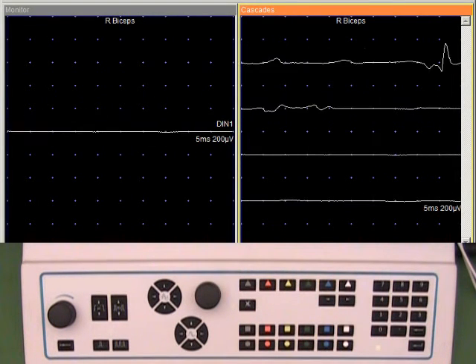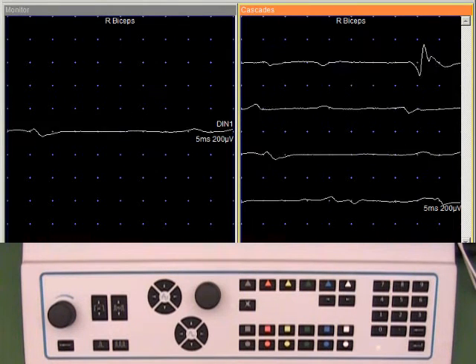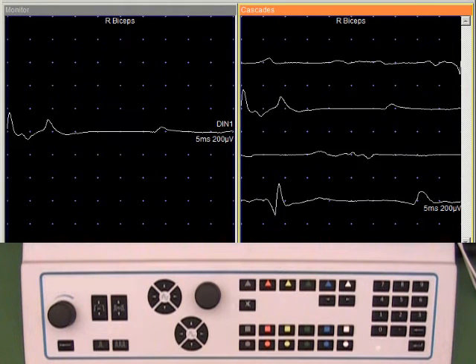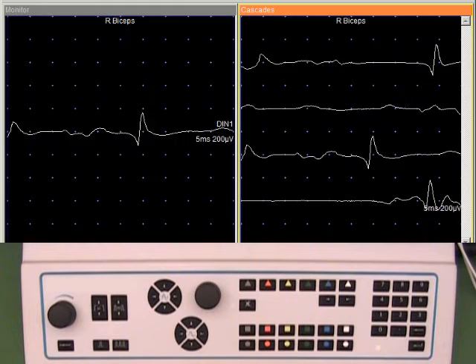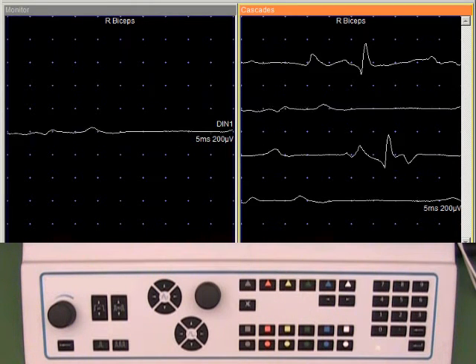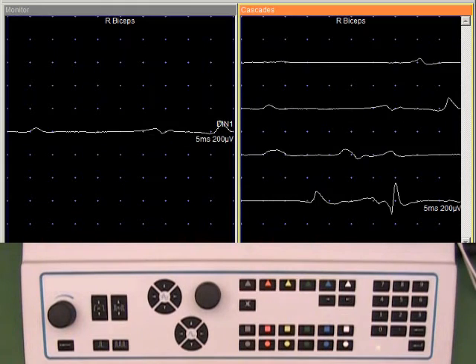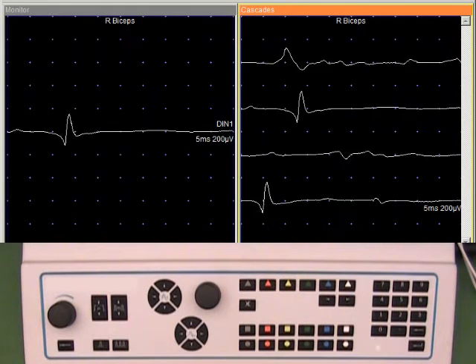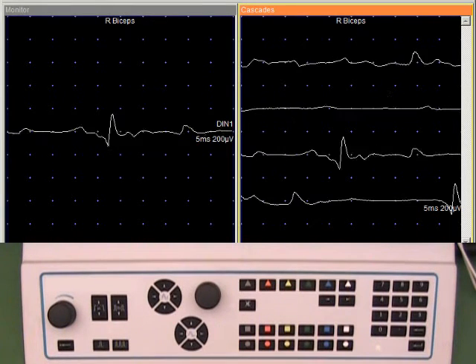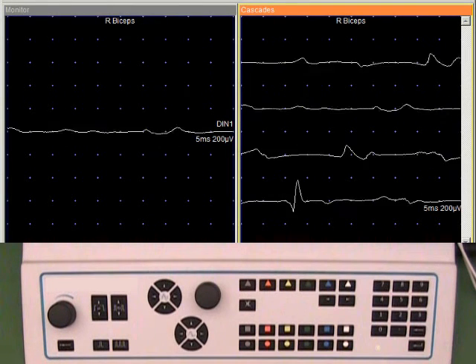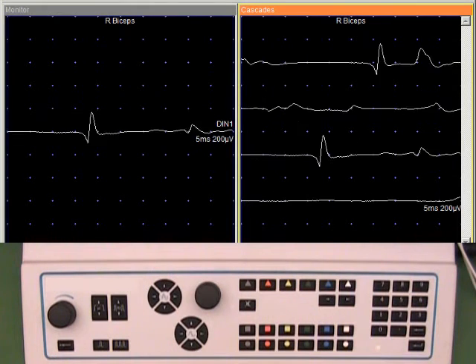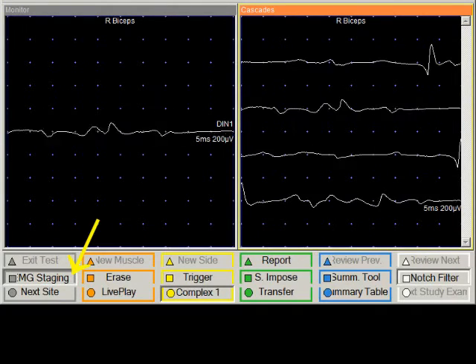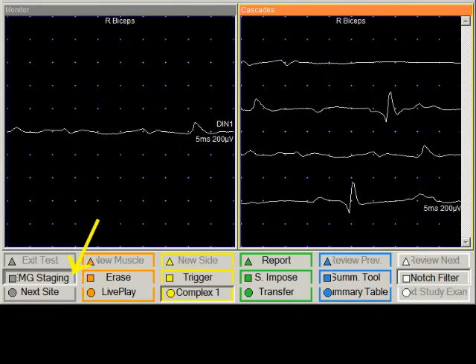Having observed the motor unit potential waveforms, we would like to look at the recruitment or interference pattern at maximum effort. The signals will be higher in amplitude and will require a change in the gain. It also makes it easier to assess the recruitment by using a longer sweep duration. Both of these tasks are accomplished quite easily by using the EMG staging capability.